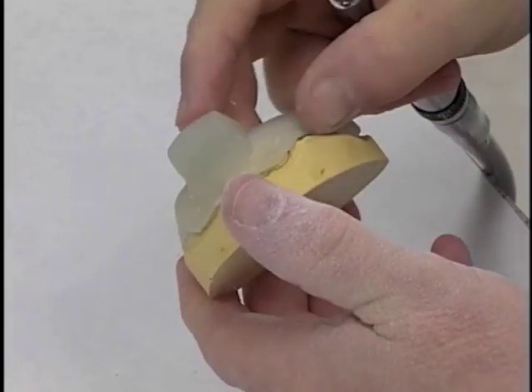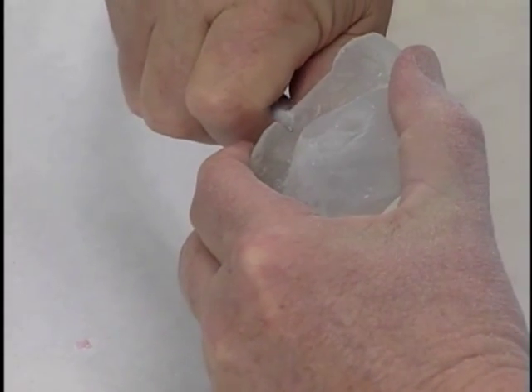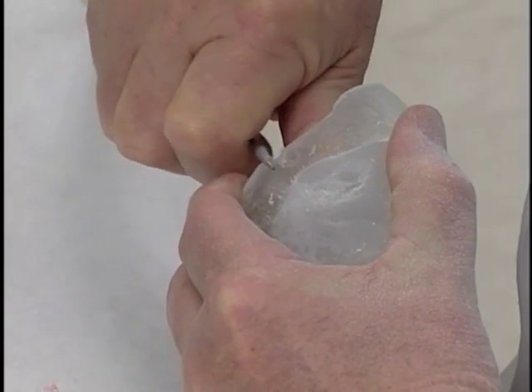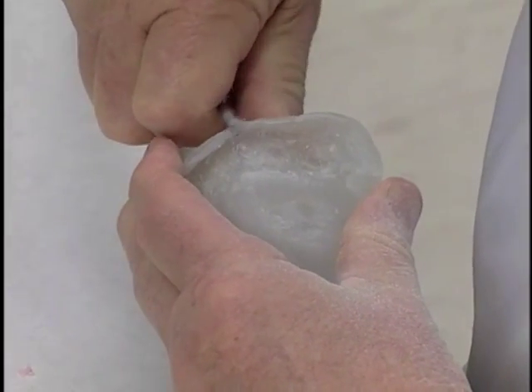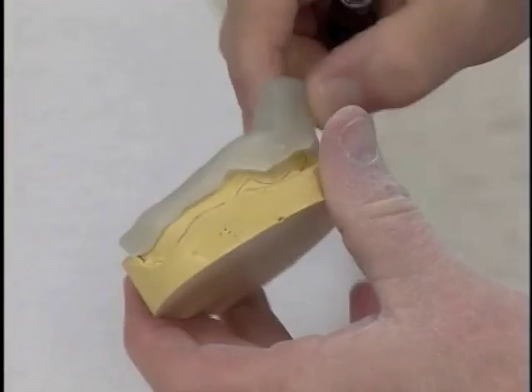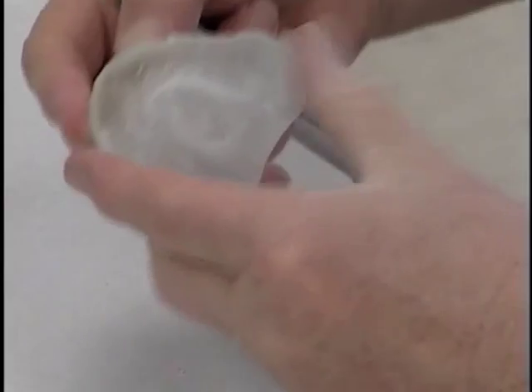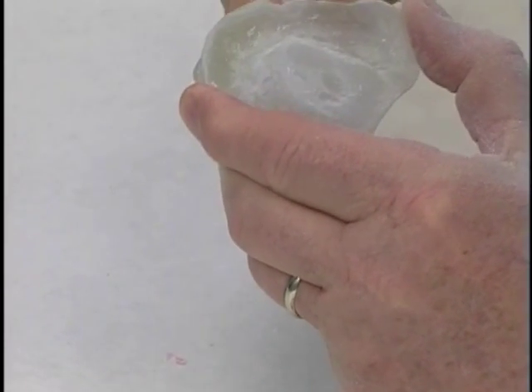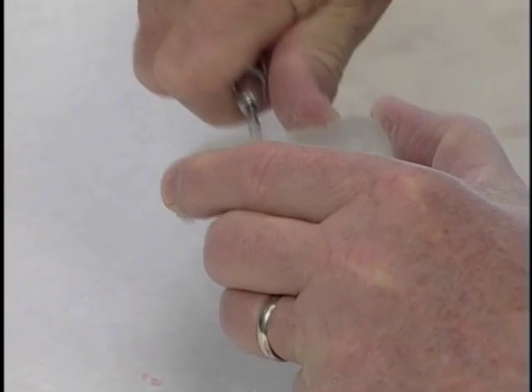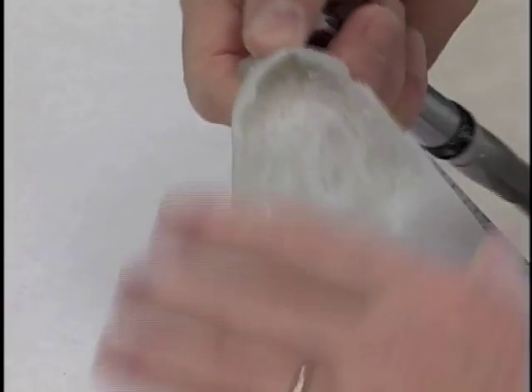Now we're going to do the same on the other side. Almost there. And now we need to trim for the labial notch, the labial frenum.